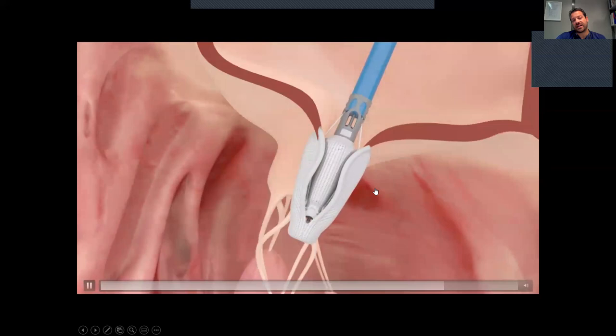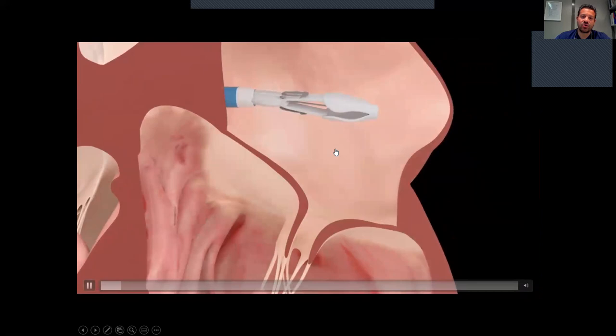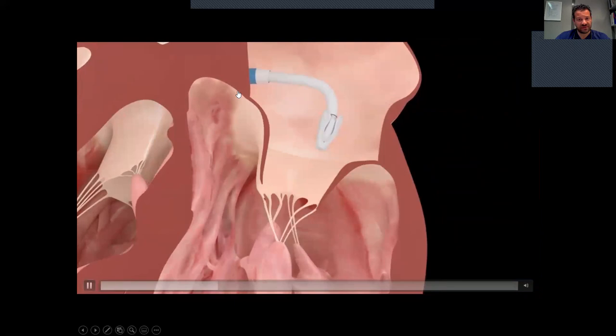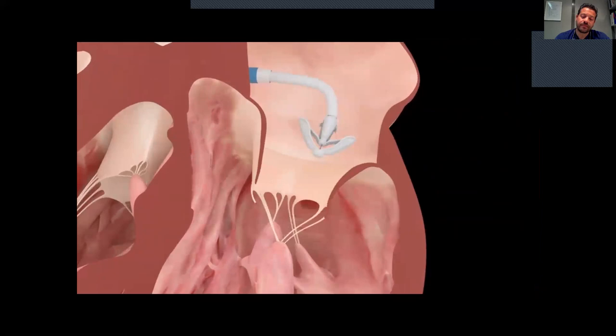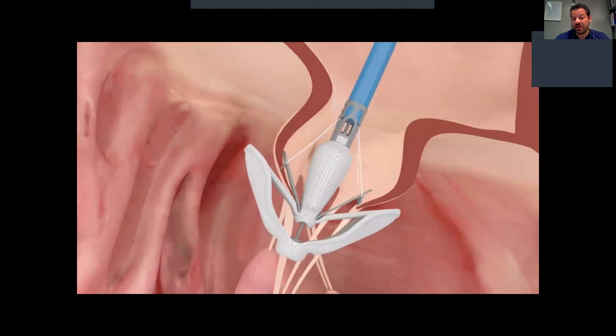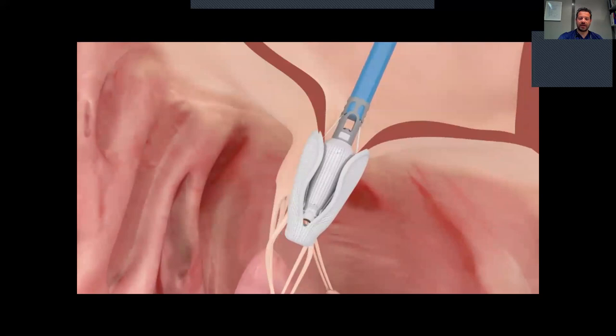If we don't like the grasping, we can re-grasp independently the leaflets. This device is delivered from the femoral vein through the inferior vena cava and right atrium; we perform a transseptal puncture and the delivery system goes into the left atrium — these steps are exactly the same as with MitraClip. For operators experienced with MitraClip, the familiar images make the transition to Pascal easier.